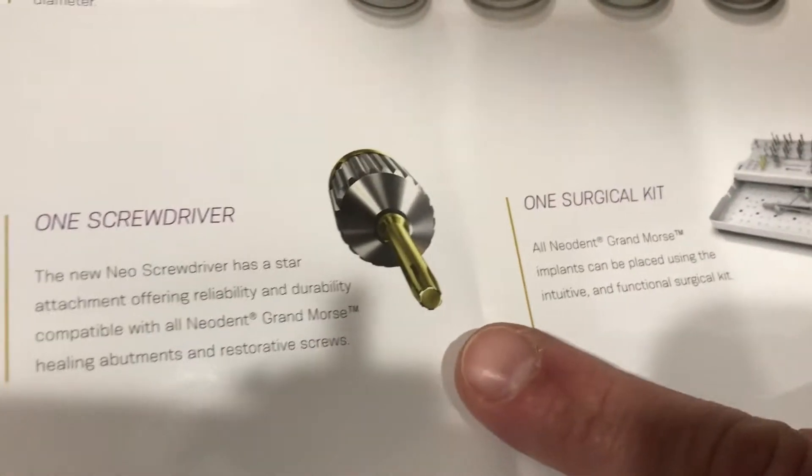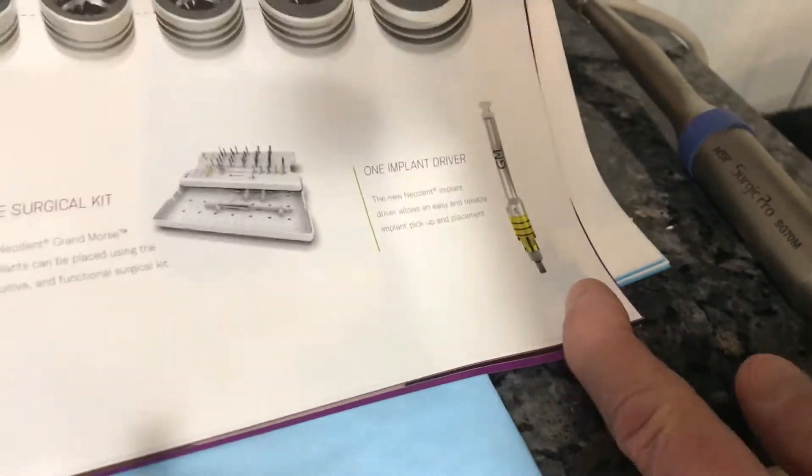Another nice feature: there's one screwdriver — it's a star-type driver. And same with the implant driver to go inside. So we're going to review the kit.